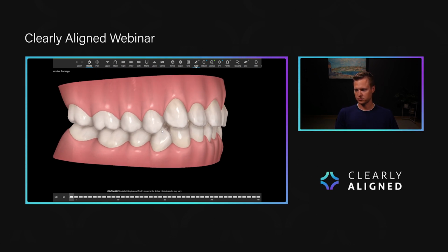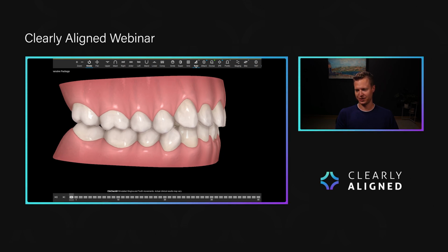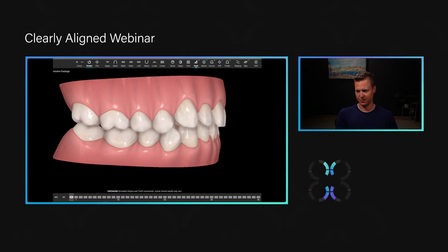Okay, cool. So elastics. Do we need them? Yes, we need them to help extrude and intrude the teeth in quad 1 and extrude the teeth in quad 4. Anterior posterior, do we need them for that? And actually, let me just leave that here. So anterior posterior, no. Crossbite, no. Vertical, yes. AP correction, nope. Okay, and then are they going to be in the proper location? Well, we don't have them right now, so I need to move them all in the right spot. Okay, so here's everything that I'm left with that I need to adjust to give myself a great treatment plan.